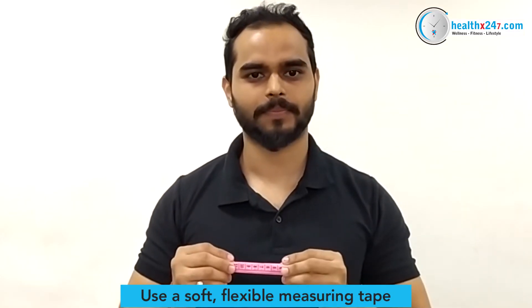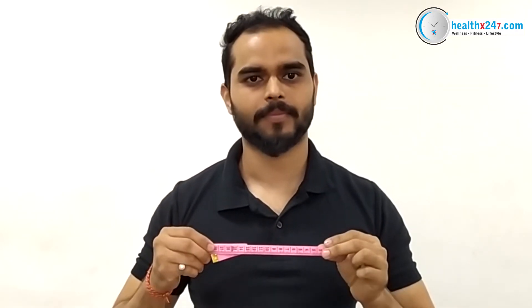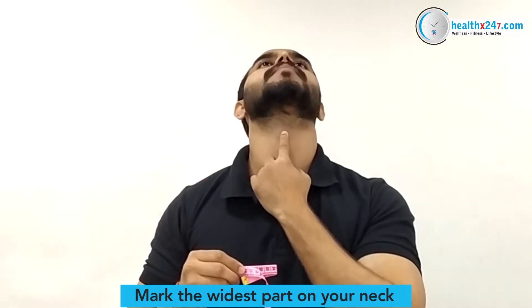Take a measuring tape. Be sure to use the centimeter side of the tape. Mark the widest part of your neck, the Adam's apple.